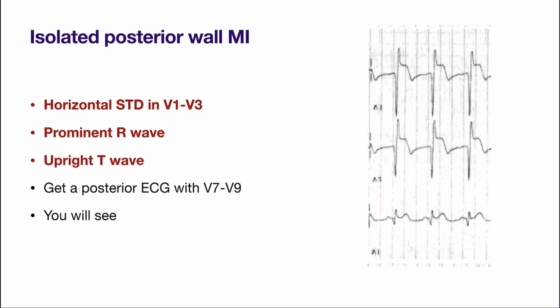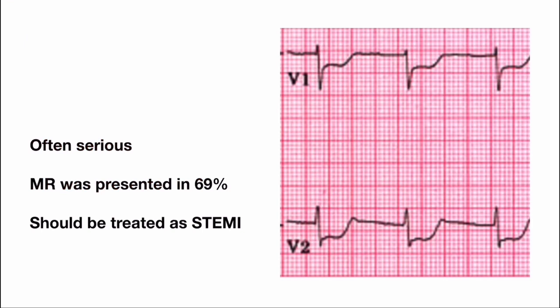What you see in V1 to V3 is actually a vertically flipped image of the posterior wall — it represents true ST elevation in the posterior wall. Don't forget about this pattern, as it is often a serious condition associated with mitral regurgitation in around 70% of cases and should be treated as ST elevation MI. Always remember: ST depression in V1 to V3 may represent isolated posterior wall STEMI.